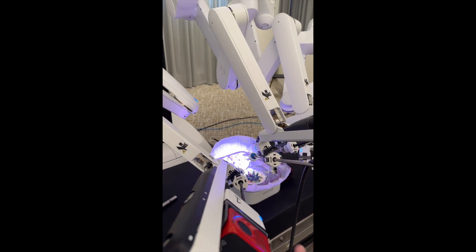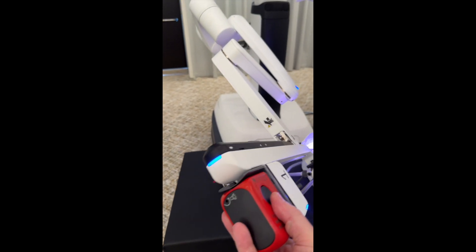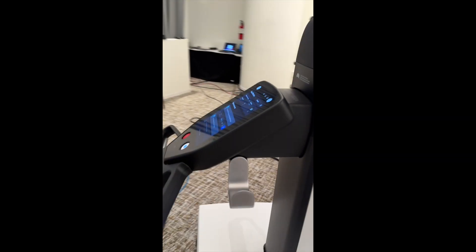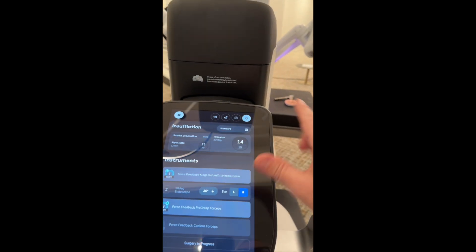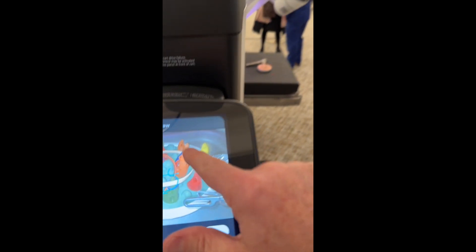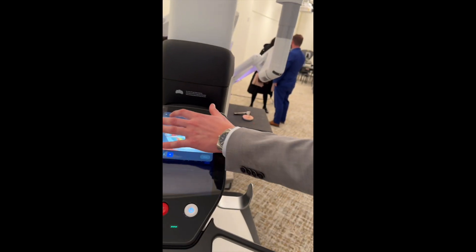It looks like I'm filming an infomercial, but I'm just excited about it — I'm not getting paid for it. One thing I want to show you: these are the haptic instruments. But you could actually put a regular instrument in it — you could put an old da Vinci instrument, it would still work, but it would not have the haptic, it would not give you the force feedback component. And this interesting part here is that you could do a lot from here, including telestration — so if you're a surgeon teaching your fellows, you could give them tips from here without going anywhere else.